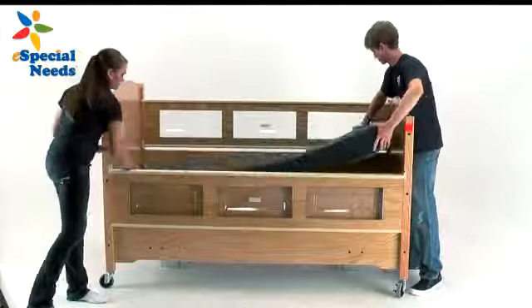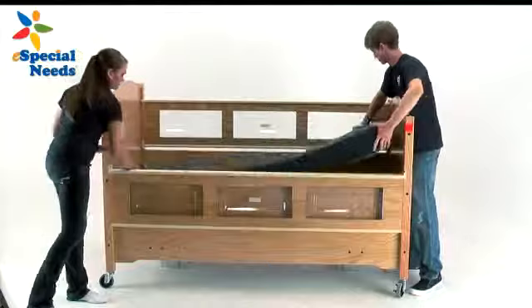And if all fits, then your SleepSafe 2 Hi-Lo Safety Bed assembly is complete.